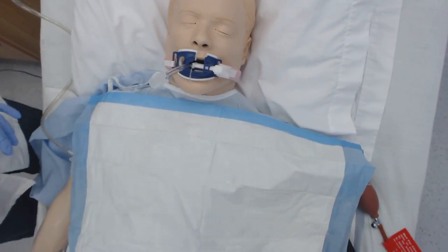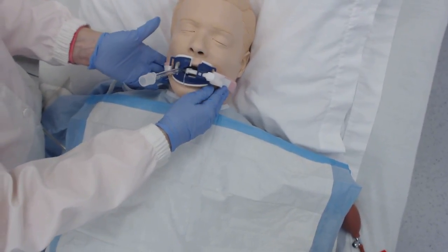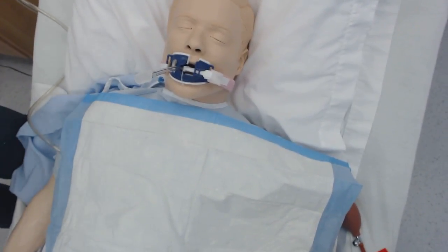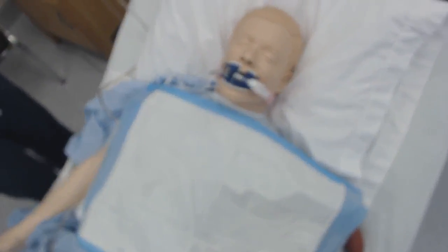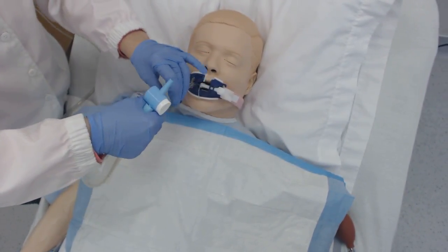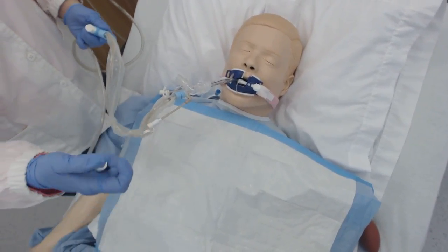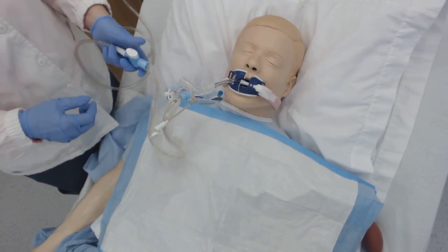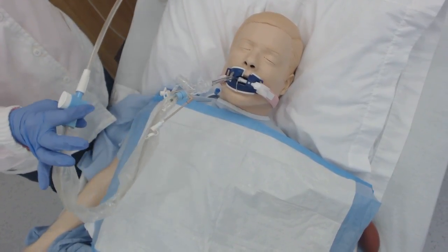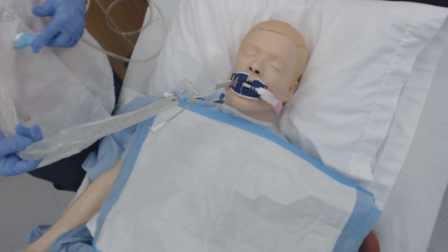This goes in the garbage. Now the patient is ready to be set up for ventilator care. I can place the patient on the ventilator, but before I do that I'm going to put the closed system suctioning on. Now I can do a closed system suction.